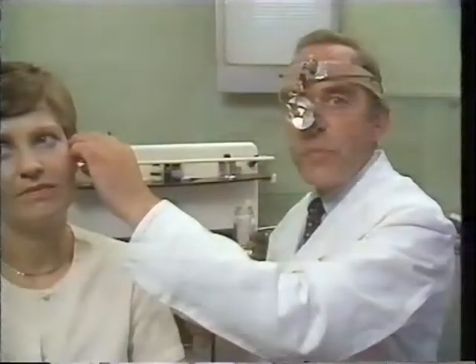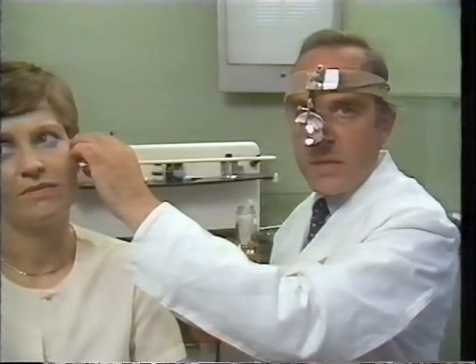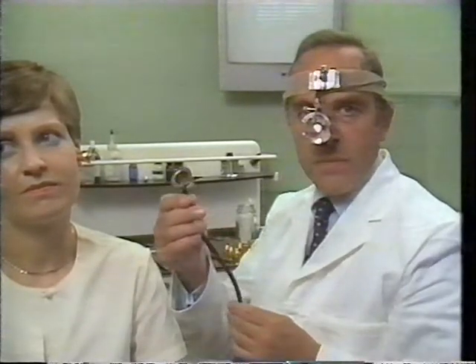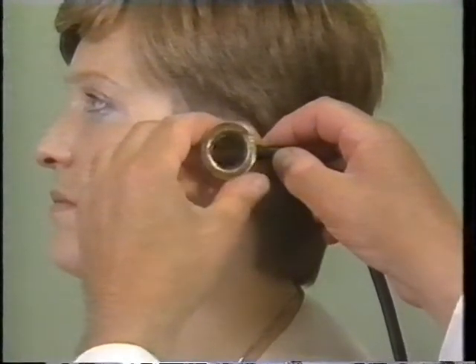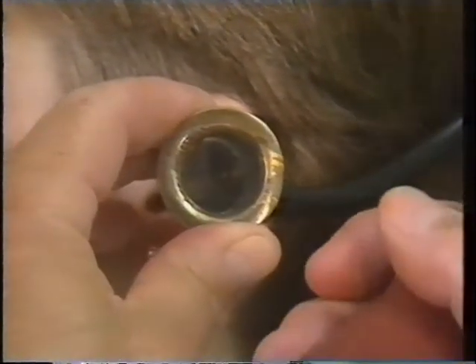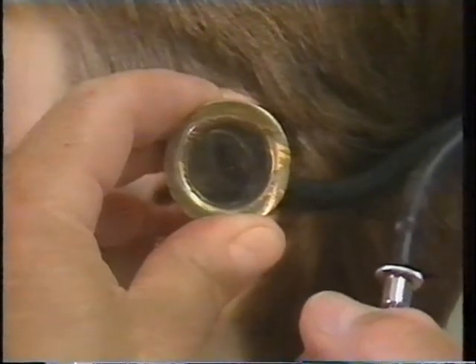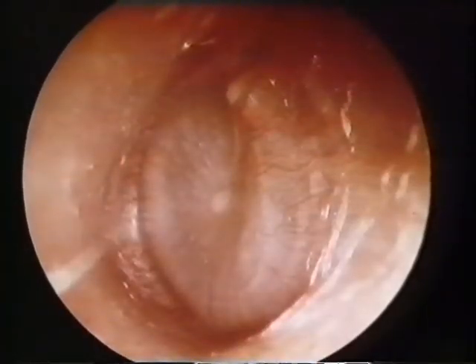In order to recognize the presence of a middle ear effusion, the mobility of the tympanic membrane needs to be assessed. This is done with a Siegle speculum, which is attached to the ordinary speculum. When the bulb is squeezed, changes of pressure cause the membrane to move and may suck fluid out of a small perforation. Effusions may not be visually obvious, and an immobile tympanic membrane is often the most useful diagnostic feature, but changes in its color and vascularity may also suggest an effusion.